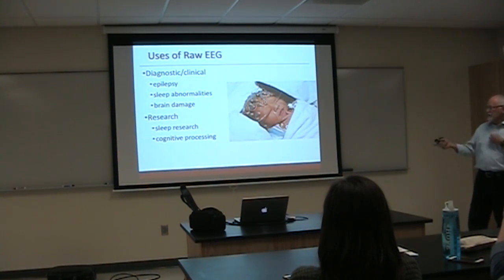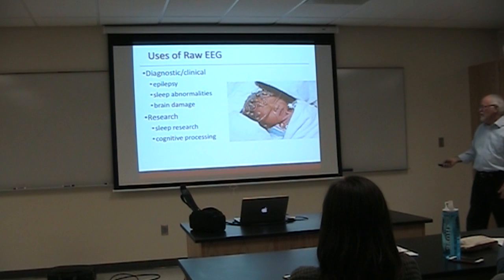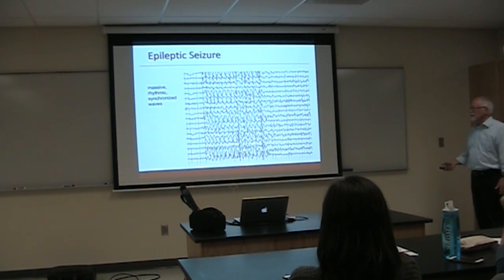Raw EEG is also used in sleep research and to a lesser extent in some types of cognitive activities, such as the overall activity of the left hemisphere compared to the overall activity of the right hemisphere.